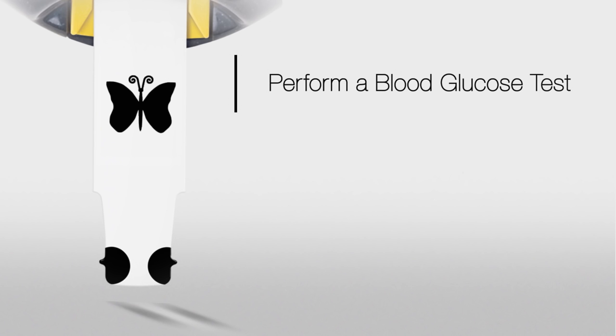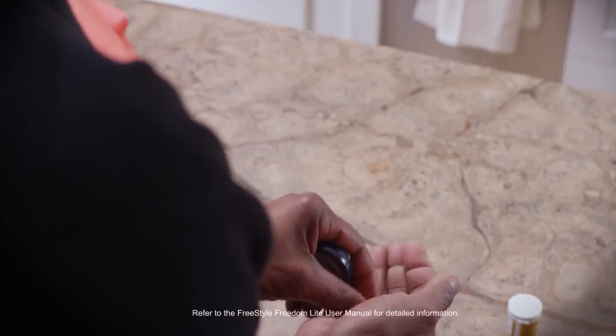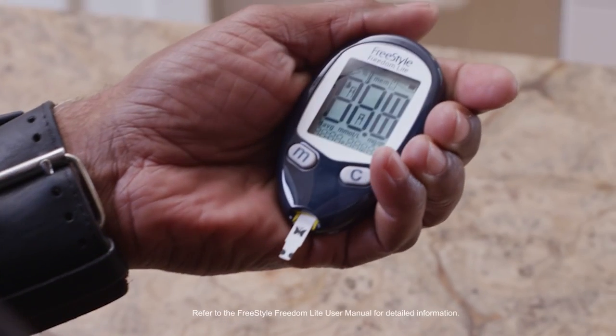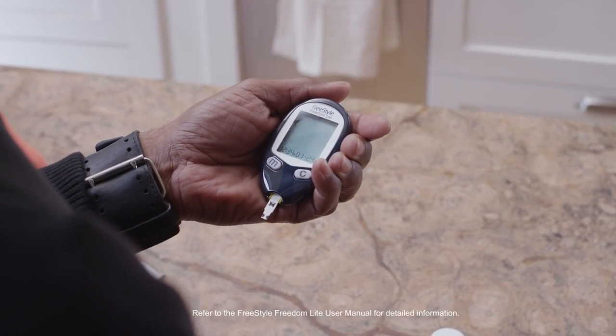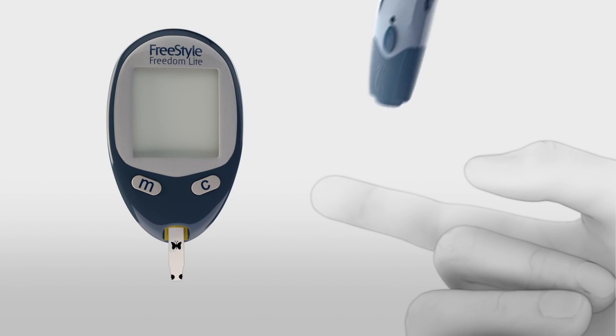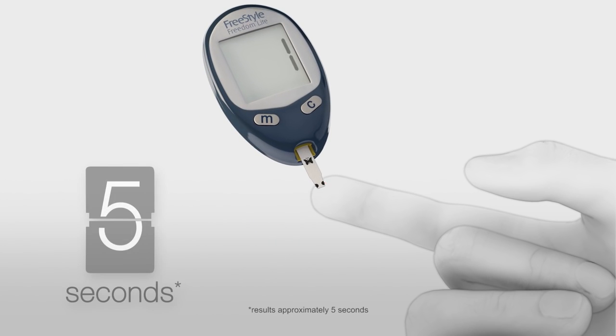You're now ready to perform a blood glucose test. Wash your hands well before performing a test. Activate the meter by inserting the test strip. When the blood drop icons appear, use the lancing device to obtain a drop of blood. Hold the blood drop to the test strip sample area until you hear a beep.